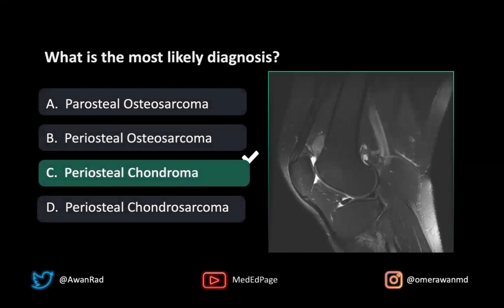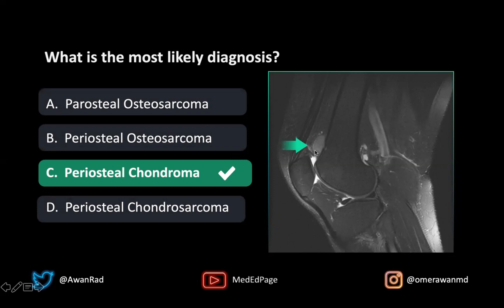This is none other than a periosteal chondroma. The key features are that it's metaphyseal, bright on T2, lobulated like a lot of chondroid tumors, with saucerization of the cortex and no surrounding bone marrow edema. Those are the key distinguishing features that lead to this diagnosis.